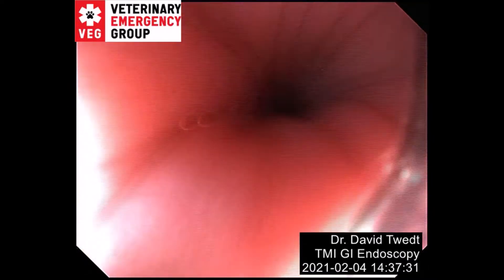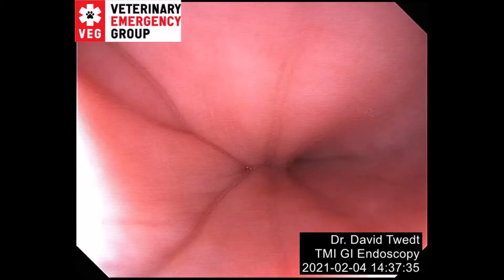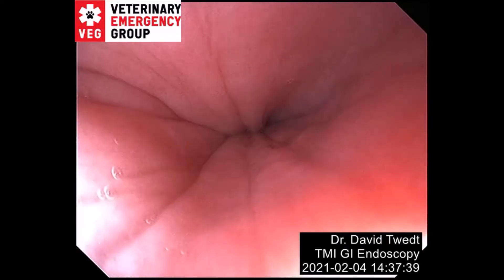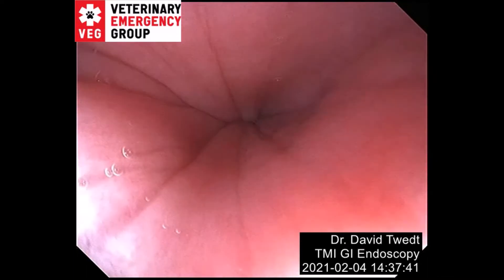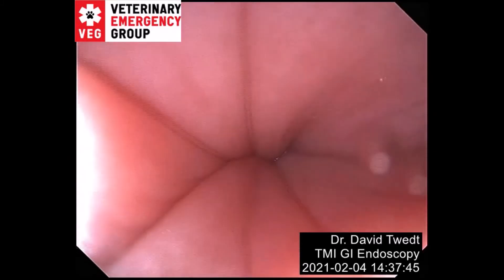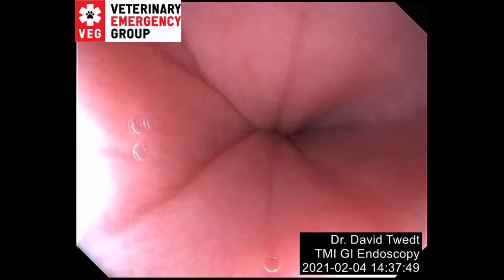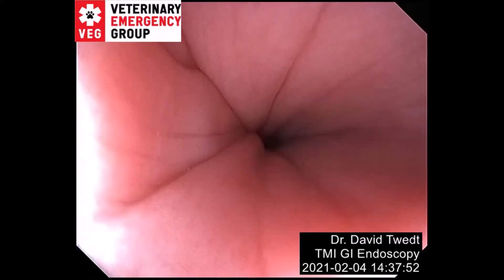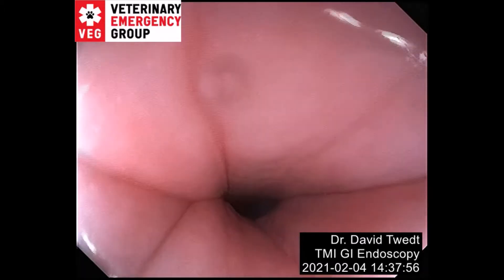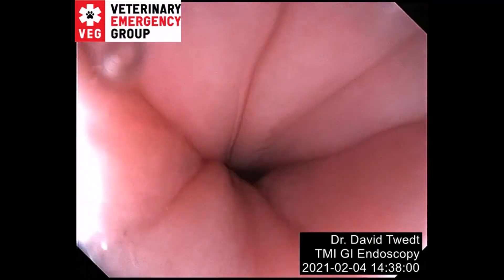Other rules: the person scoping — never, ever, ever — cardinal sin to take your eyes off the screen. Because you'll be amazed at how much can change even just that one moment. Everything else about the dog is somebody else's problem. This is your job. We talked about using the esophagus to already practice. So demand of yourself that you put things in the middle.